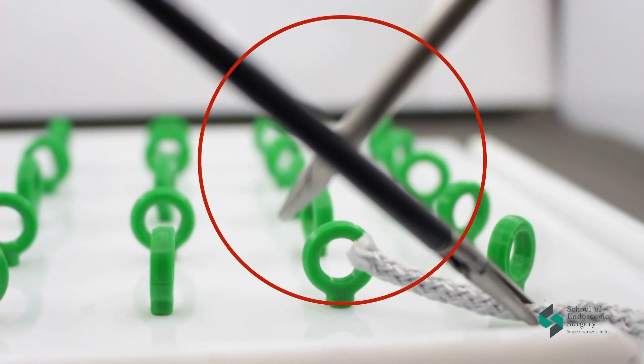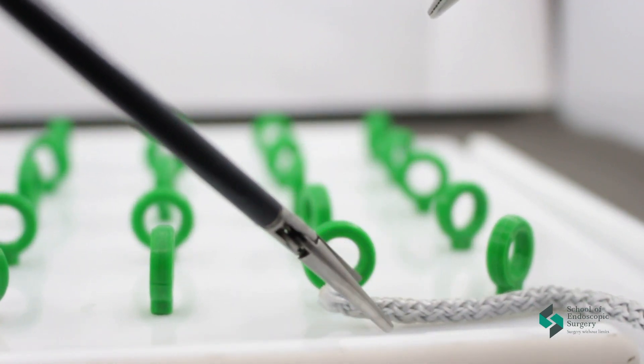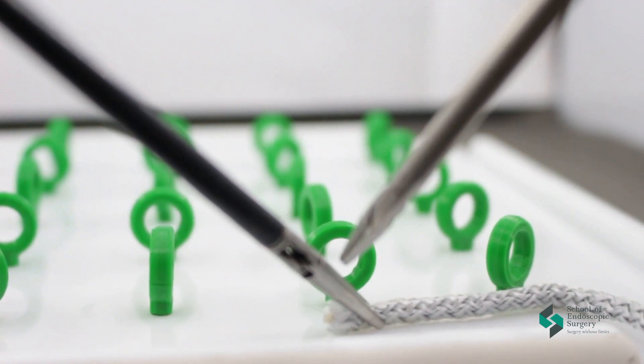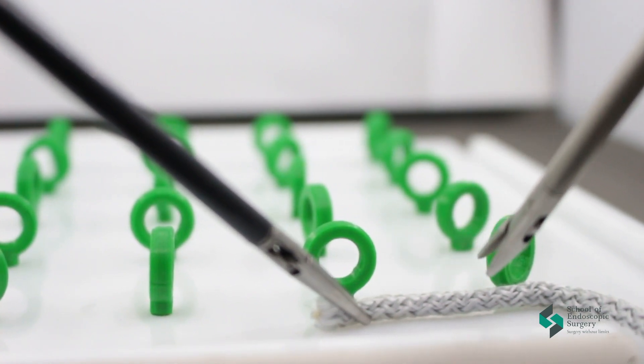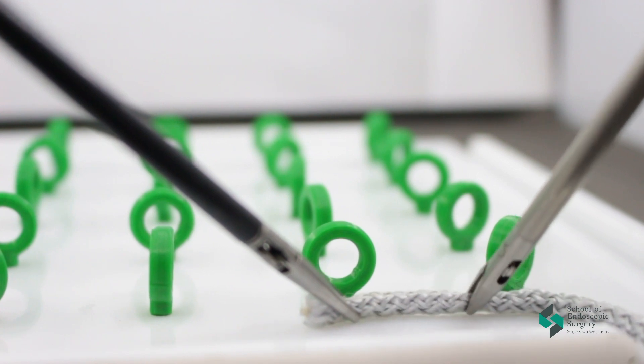The first rule is never cross the instrument. The second rule: always look with the dominant hand in which direction you will direct the instrument or needle. If you lead to the left, work with the right hand, and if you lead to the right, work with the left hand.